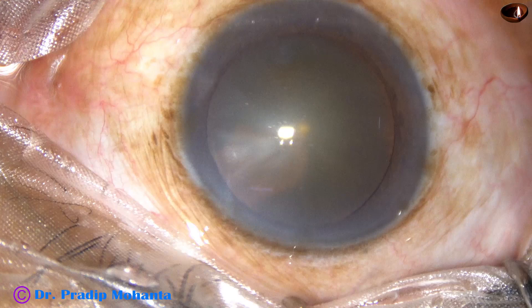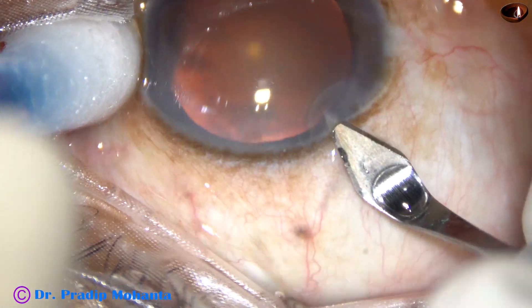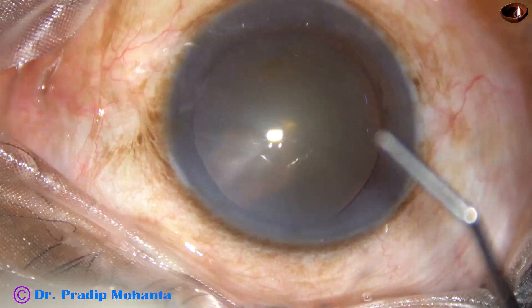This is a cataract with grade 3 nuclear sclerosis. At this moment it appears like a very soft cataract, but when we divide the nucleus into several pieces we will see that it is not as soft as it appears.